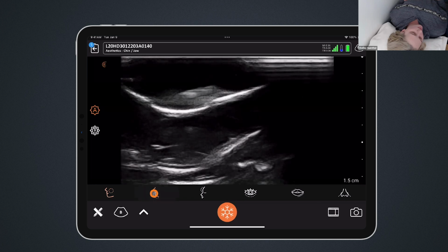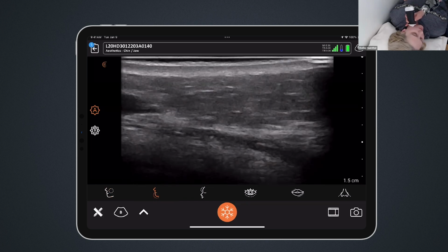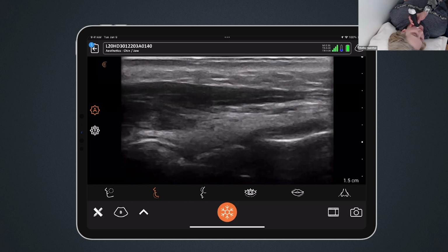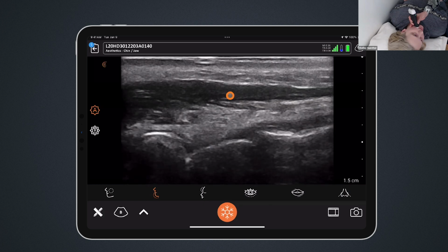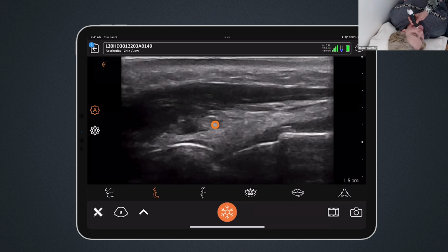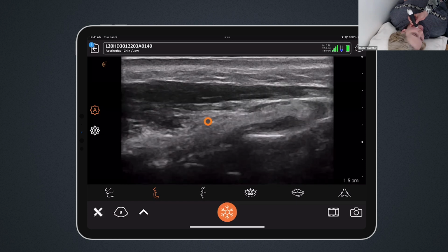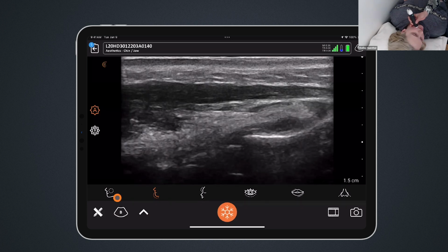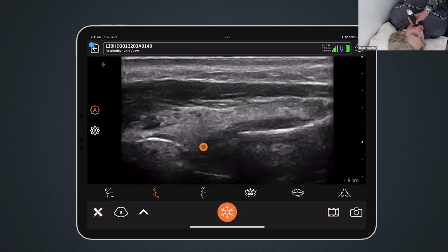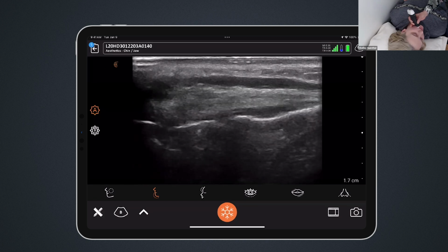So I'm going to select the jaw preset here, and I'll start with the DAO, where Dr. Weiner was just showing me earlier how to find the DAO, which I believe is this right here. Is that correct? That's it. It's one of the great landmarks of the lower face. Yeah, you can't miss it. And there's the mental foramen. You just passed it. Oh, right there? No, on the left. Oh, no, there it is. I think my depth is just a little bit off. There. Yeah, okay. Excellent. Right there.